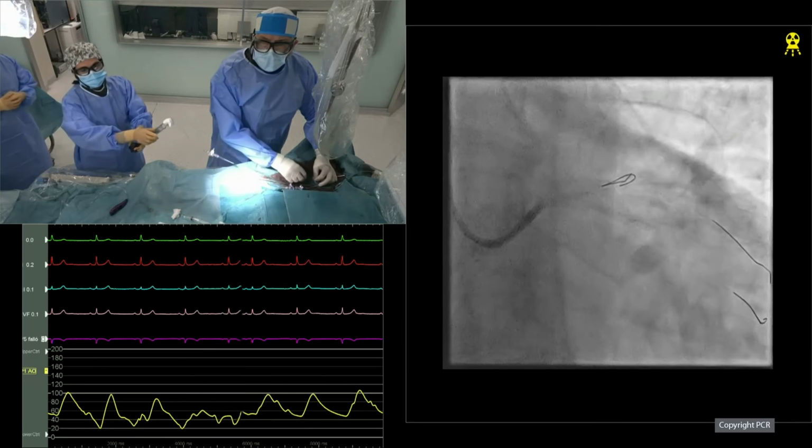So, talking about the sizes of the balloons for the kissing, we did not want to interfere there. What they did is a very nice example. The wire got knuckled, and because I was already about to cross the left stent towards the LAD, I just completed crossing, then brought the wire inside the balloon and advanced it again.